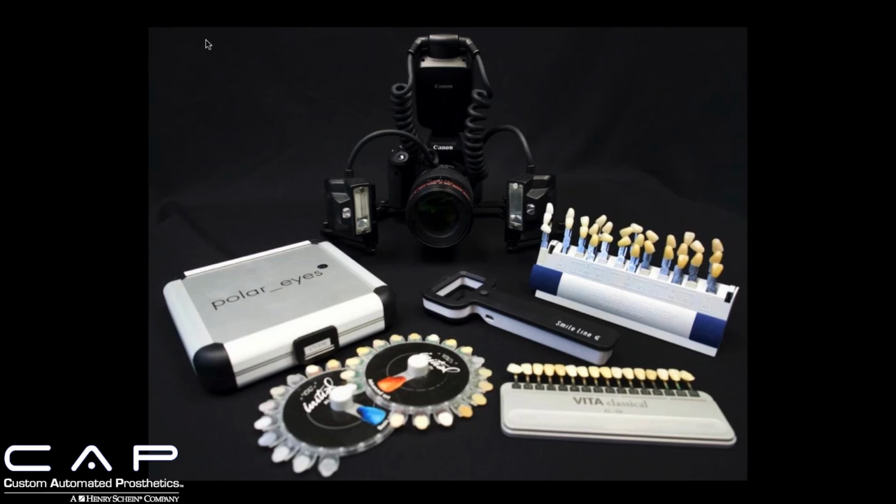And you can see in the back that's my camera. It's a pretty basic Canon DSLR with a 100mm macro lens and the Canon macro twin flash, which has become essential in my shade taking and photography in general.